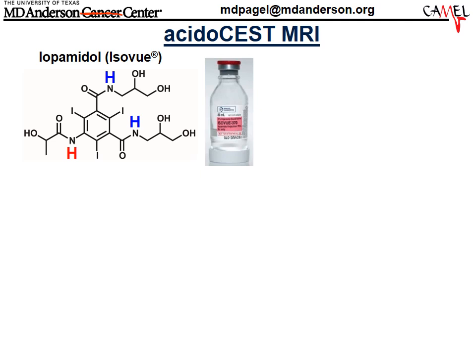How does this work in a little more detail? Here is the contrast agent again, known as IsoVu, a clinically approved agent, also known by its chemical name, iopamidol.